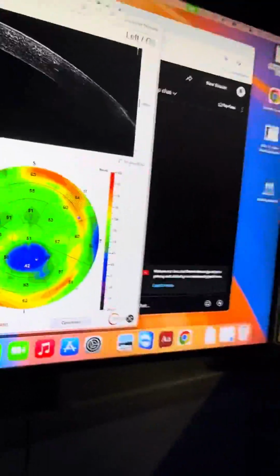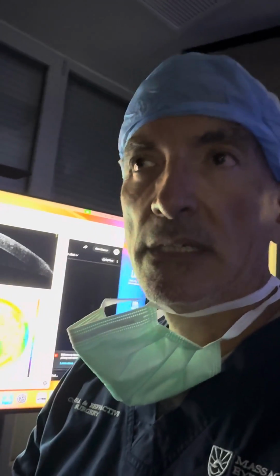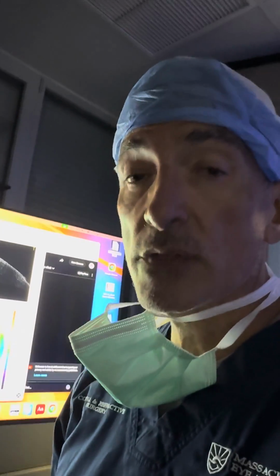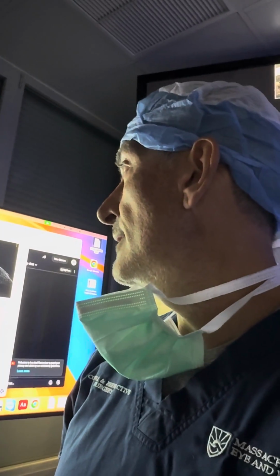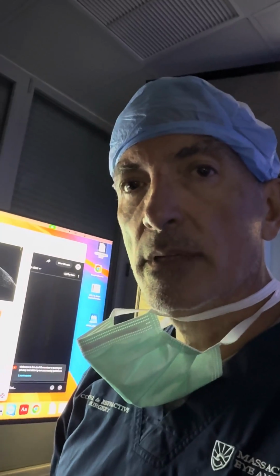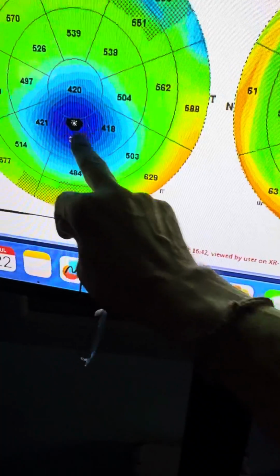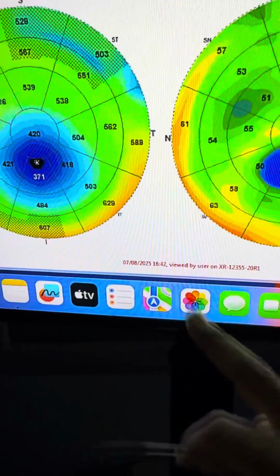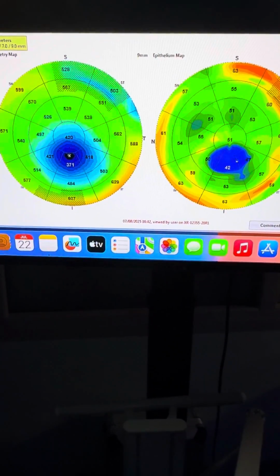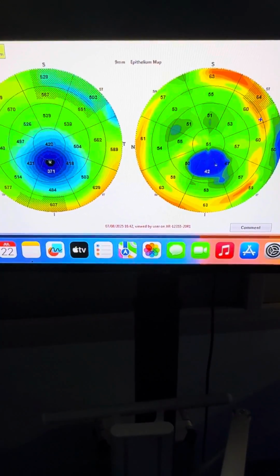Hope you found this description of a very particular Athens Protocol useful, because this is Athens Protocol number 2. We treated in 2020, so 5 years ago. We have recurrence of keratoconus from avid eye rubbing, and we will adapt and modify our treatment so it will not treat almost at all over the very thin part of the cone and mainly the periphery, knowingly creating a little bit more myopia than the patient has, but we can treat that, God willing, if the cornea stabilizes, with a soft contact lens or a phakic IOL.